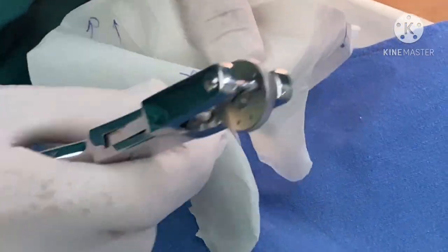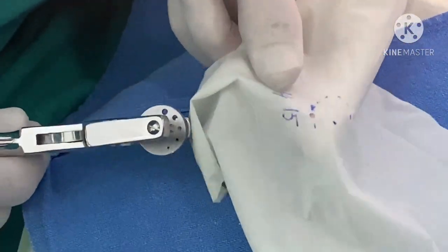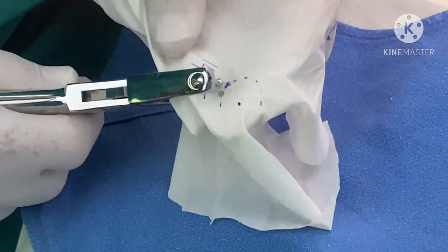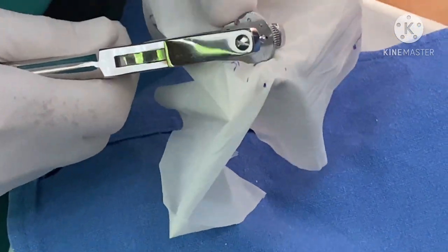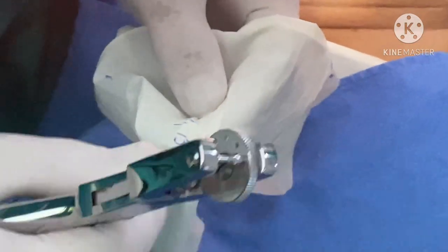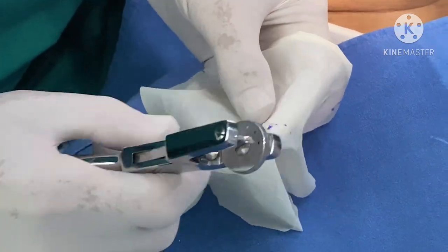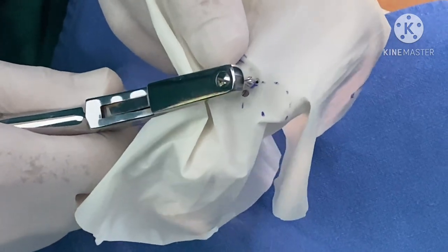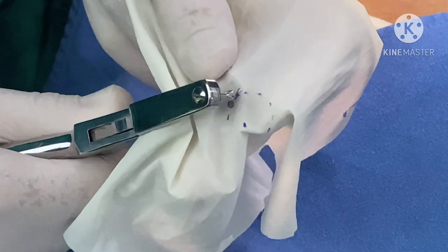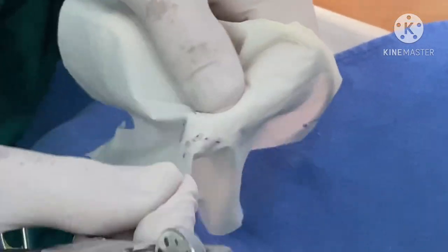right? This is how we made a punch. Then we make another punch for 1/4. Here you are. In addition, with the smallest punch, we make additional space for the step by putting 2 or 3 small holes on it. It looks something like this.